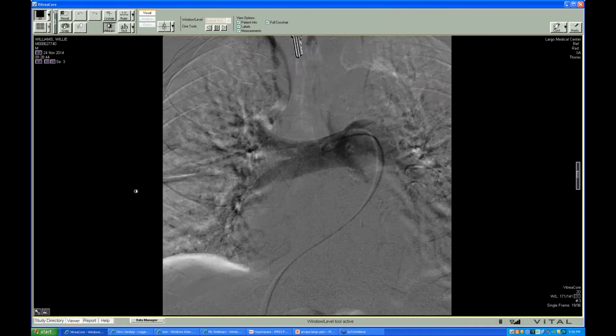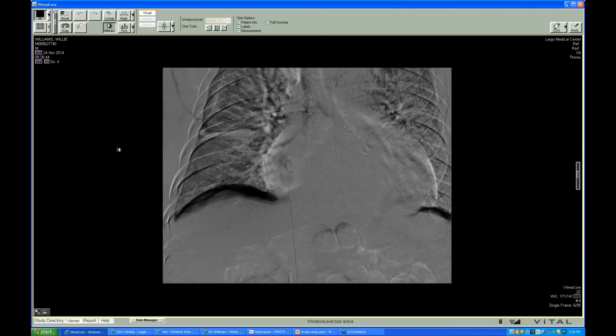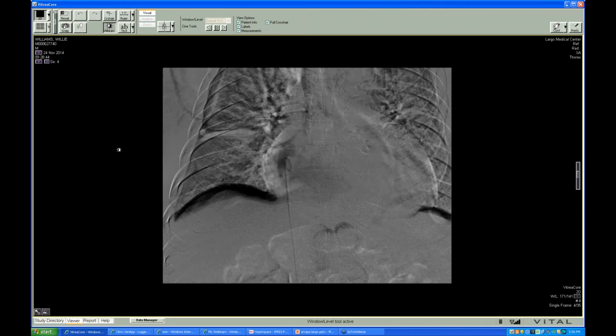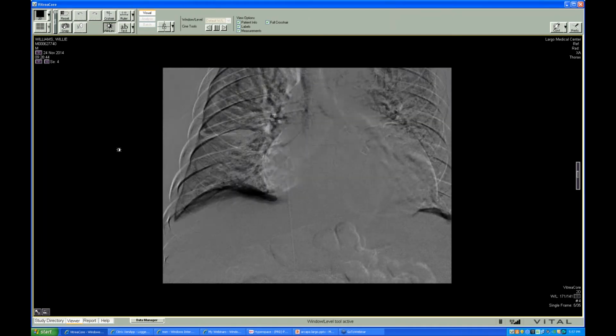I think the first one's the. I think this one's, you see it go all the way. It's not a brisk injection, unfortunately. You see the whole RV. It's so diluted out. Yeah, it gets so diluted out.